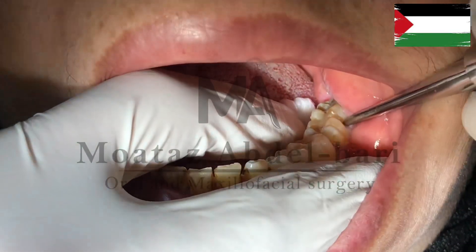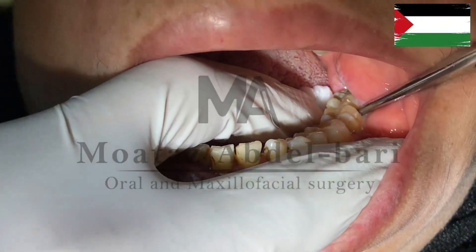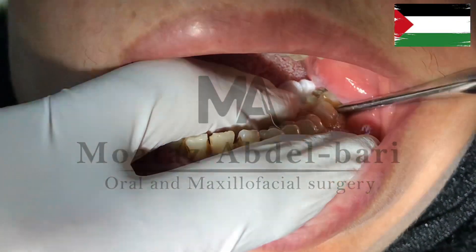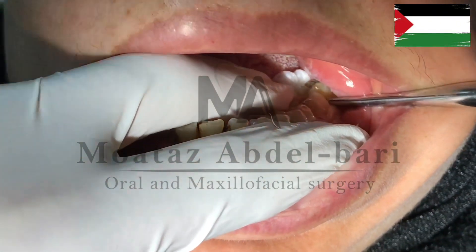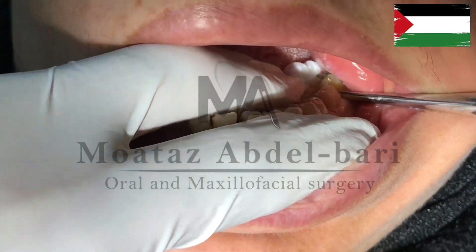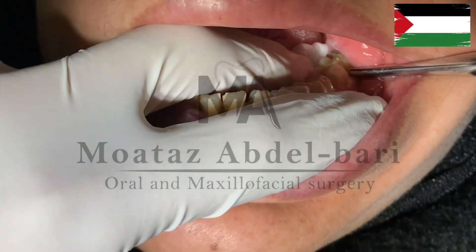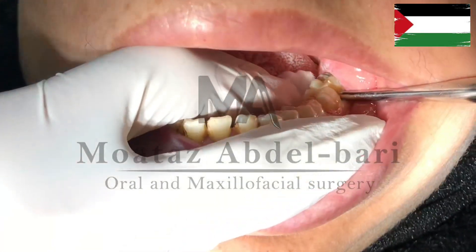Begin the luxation by inserting the straight elevator from the mesial side at an angle, then gradually steepen the angle until it is pure perpendicular to the long axis of the tooth. To confirm the elevator is securely rigid in place, you can release your hand and you should observe its retention.